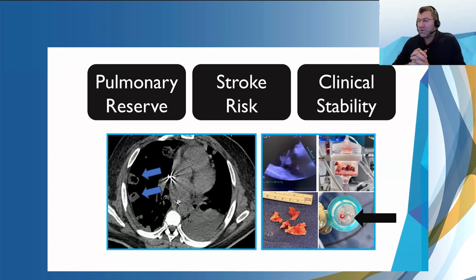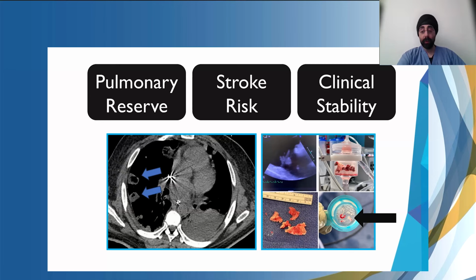And then who has seen those transient hypotension or sometimes chills if you're doing it under conscious sedation once you disrupt that vegetation? Maybe you want to comment on that. Has anyone seen excessive hemodynamic compromise with that? I mean, we certainly will see transient bacteremia, or at least the effects of it, right?